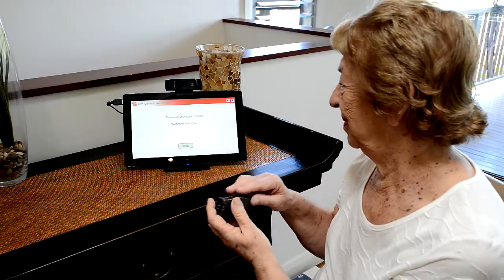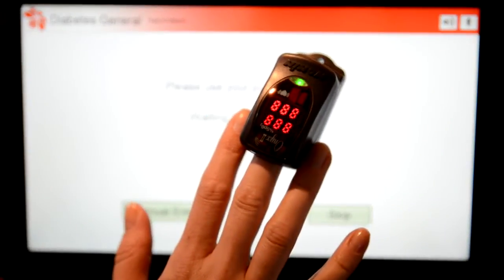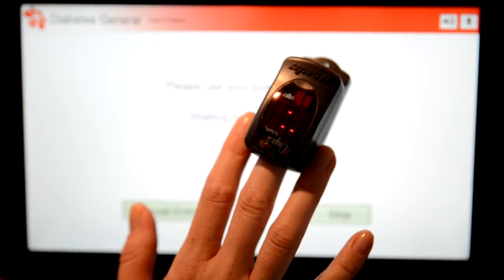When prompted to use your pulse oximeter, begin by holding the finger sensor so that the display is on the top, and gently insert your finger.